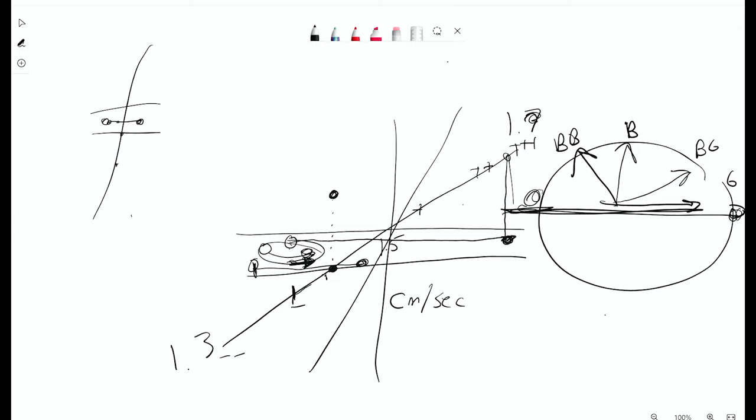A handy thing that I've recently learned is, because the majority of my phase contrast experience is with cardiac imaging, I find that a patient having an MRI of their heart has typically already had an echo stress, and on those echo reports is where you can find the optimal Venc. The echo reports are typically in meters per second, so you have to convert a little bit. In cardiac, that's a really good cheat code, because the patient would typically have had an echo. You just have to convert meters per second to centimeters per second.